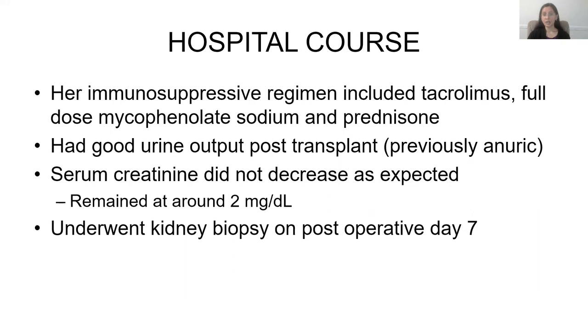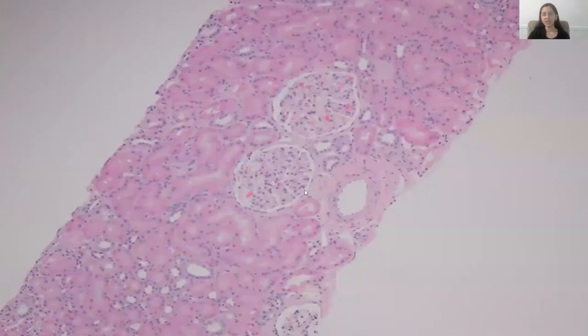She had good urine output post transplant. However, her serum creatinine did not decrease as much as we expected. It remained around 2. As a result, we did a kidney biopsy at post-op day 7. This was the result. Here you can see that this is a very good looking kidney.